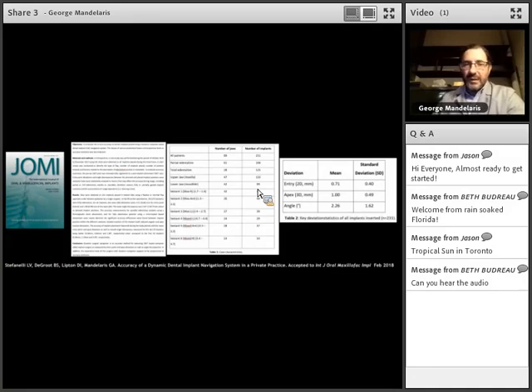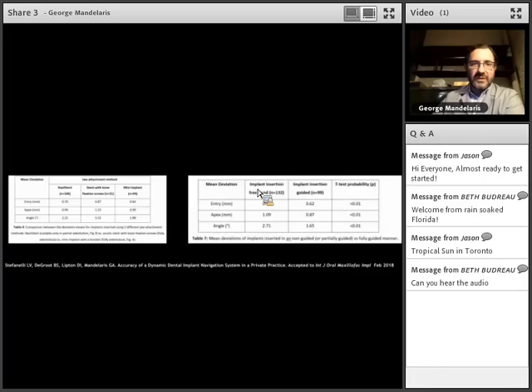You don't need to be a Michelangelo of prosthodontics to have an amazing prosthetic outcome when you have numbers like this. So as a surgeon, that's what I'm trying to hit all the time for my restorative dentist, to be the very best I can be to get the implants in the ideal and most accurate position possible so that they can work their magic in the restorative end.